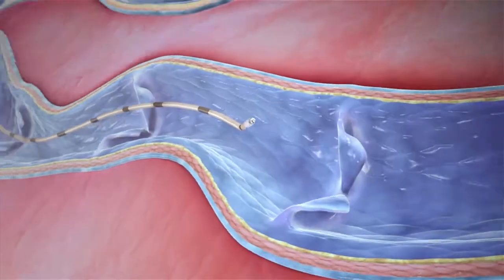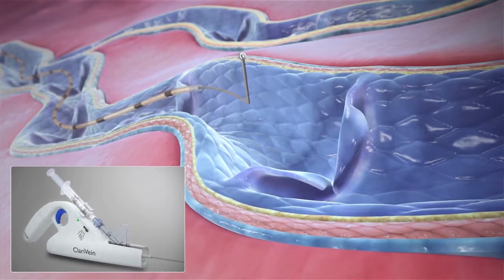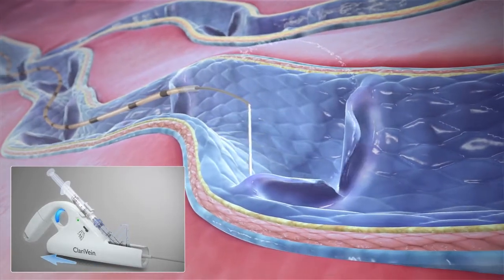Upon activation, the unique rotating ball dispersion tip rotates at approximately 3500 RPM, creating a targeted penetration.